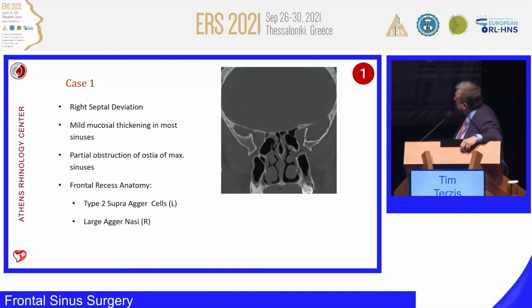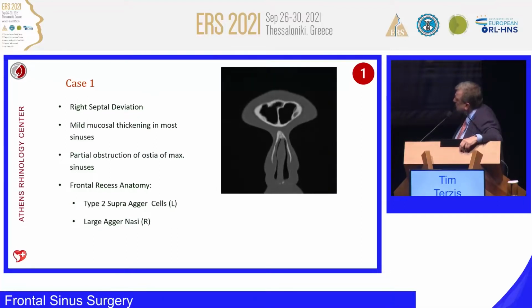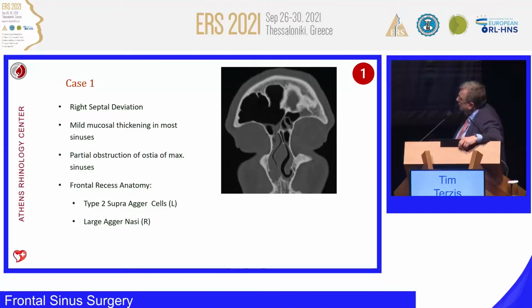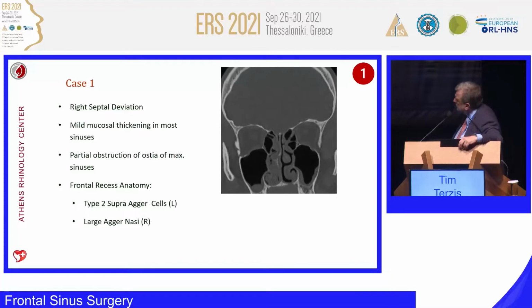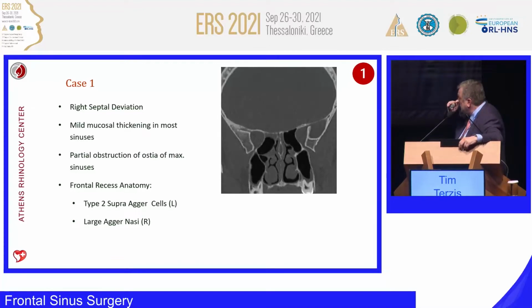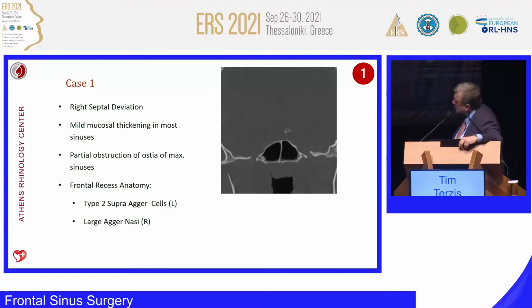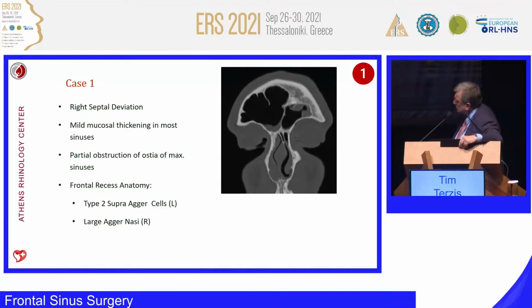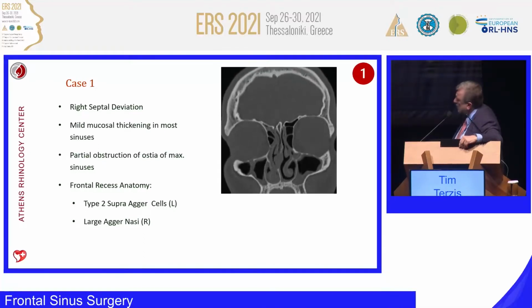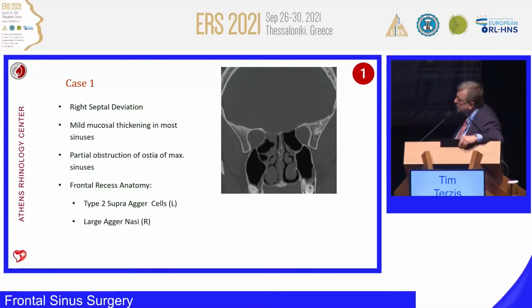And there's as well this septal spur. And maybe the septal spur is affecting and creating the pain as well, a contact headache point, maybe. So these are the options. So balloon in my hands, I wouldn't go for it because it's very complicated to go up and maybe to create more problem than benefit. And in case of surgery, I would do what I'm presenting here, the School of Graz. I would follow the anatomy and go up very gently. Absolutely. And that would be my option. Right, thanks very much. Philippe, would you like to comment, please?